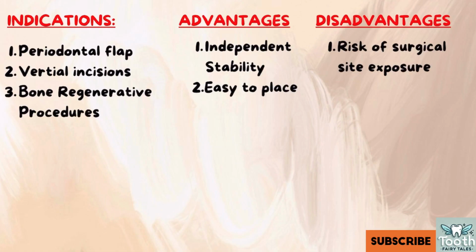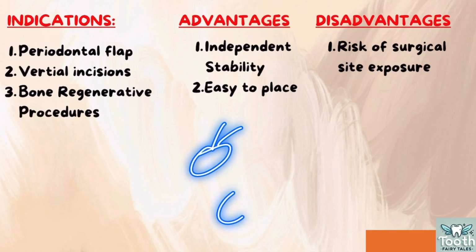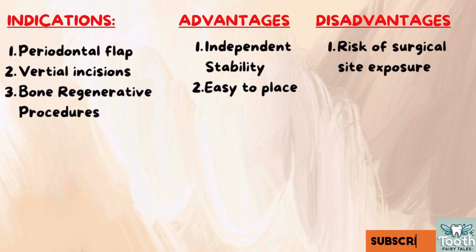Next, let us discuss the advantages of this technique. This suture provides independent stability. Each suture is independent. They are not interlinked. If one suture becomes loose, it does not affect the stability of another suture. And this technique is easy to place because it is a straightforward technique.